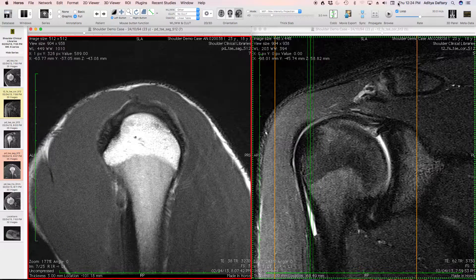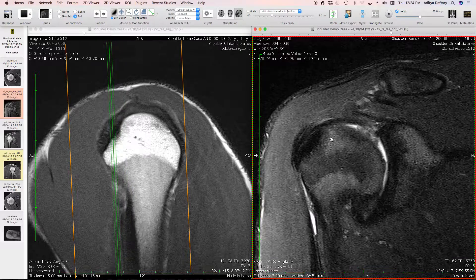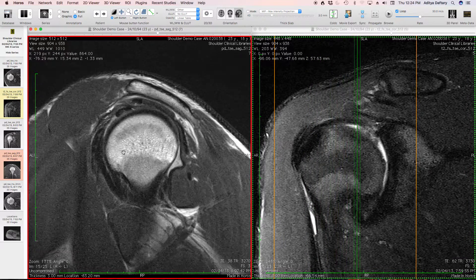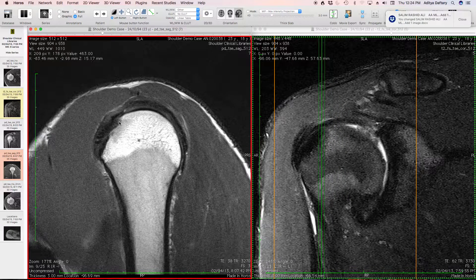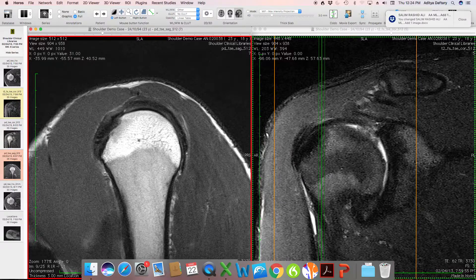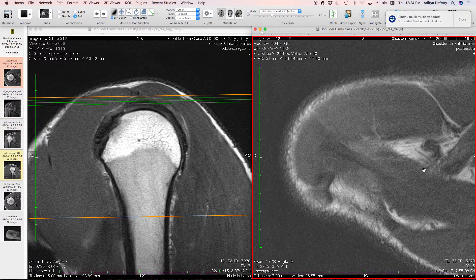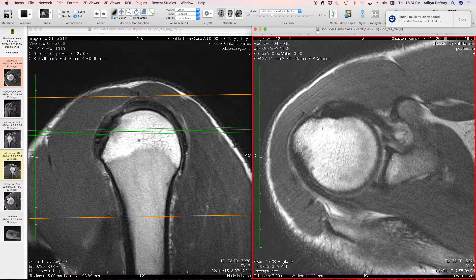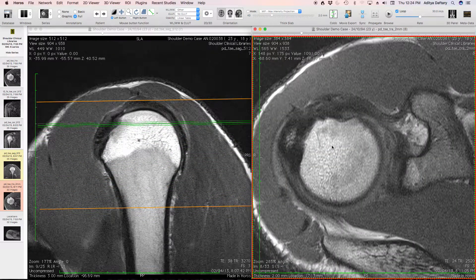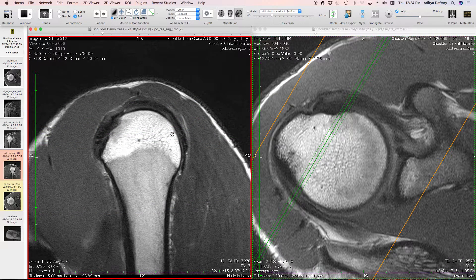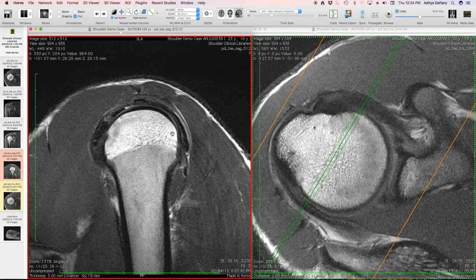The biceps tendon shows a little tendinosis as it comes across. Revisiting that bone marrow edema seen earlier, we can see it corresponds to the area where the biceps traverses across the anterior aspect of the humeral head. On axial images toward the top, there is a little bit of remodeling of the anterior aspect of the humeral head in this region — let's keep that in mind.